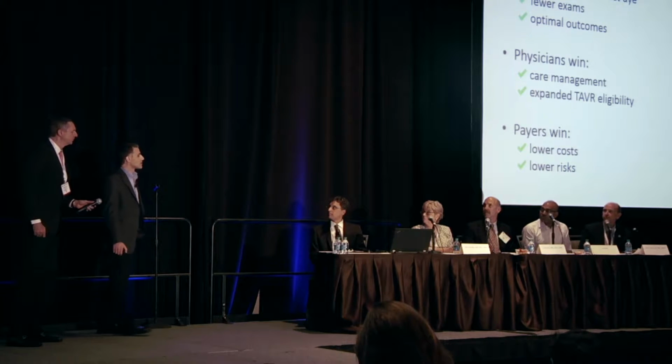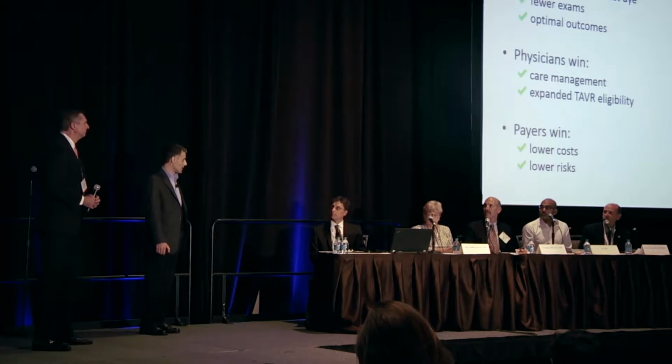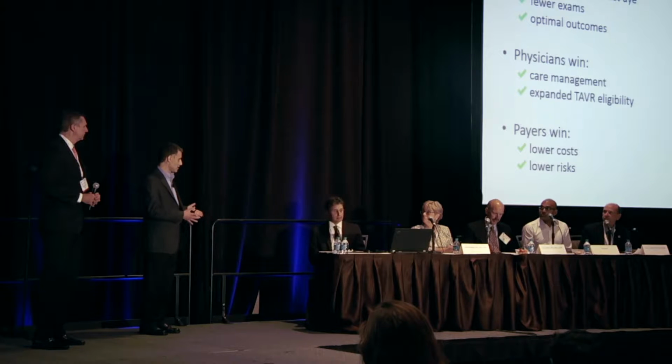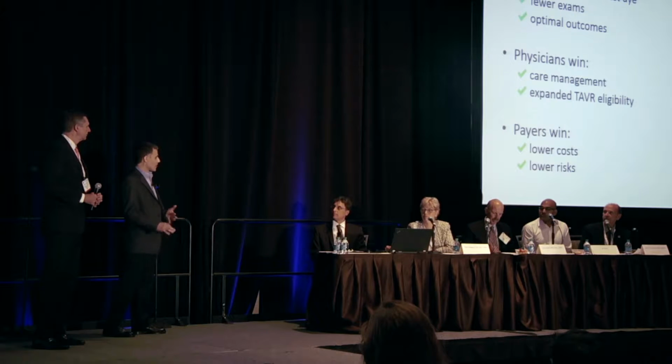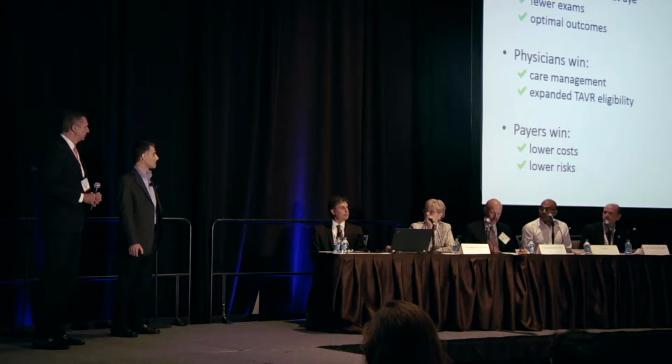Yes, we have. The software has been so far validated using 15 patients, where we take the gold standard to be CT. The annulus that was predicted from the software is compared with that of CT. We were blinded to the CT result prior to operating the software. On these 15 patients, 5 of the 15, so about 33%, would have had the improper size of TAVR valve implanted had the size of the valve been selected from 3D echo. Using our software, 1 of the 15 patients would have had the improper size. So clearly it's a clinically significant benefit for those patients.